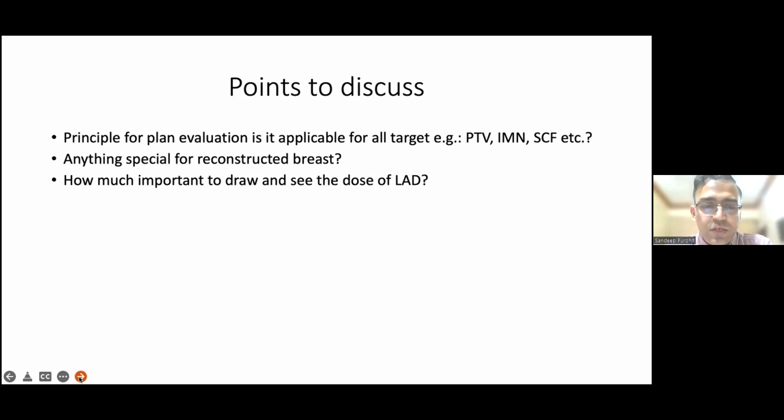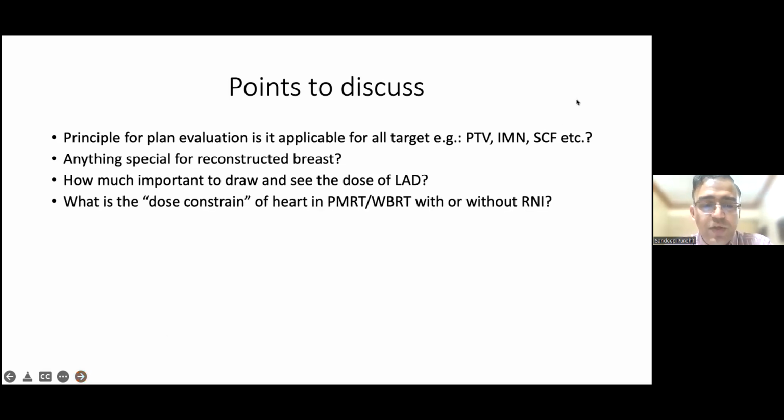Yes, sir. So in such patients, we actually advise them to go through DIBH. If they are not able to, then we make an IMRT plan for them. And then with IMRT, the doses to heart reduce from 10 to around 5 or 6 Gray. So we accept that, sir. So you are telling that when with a conventional technique you are getting a higher dose, you change the technique to bring the dose down. Yes. Normally today in 2022, probably we are not going to accept an 8 Gray mean dose to heart. What you said, sir, that comes when we do conventional.